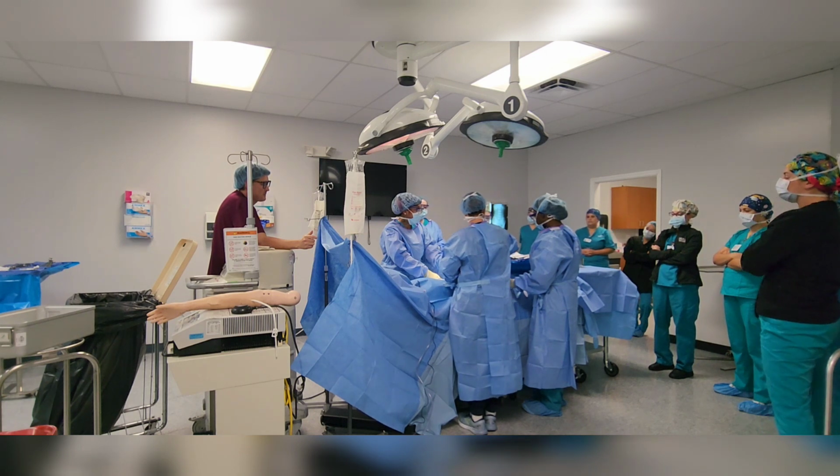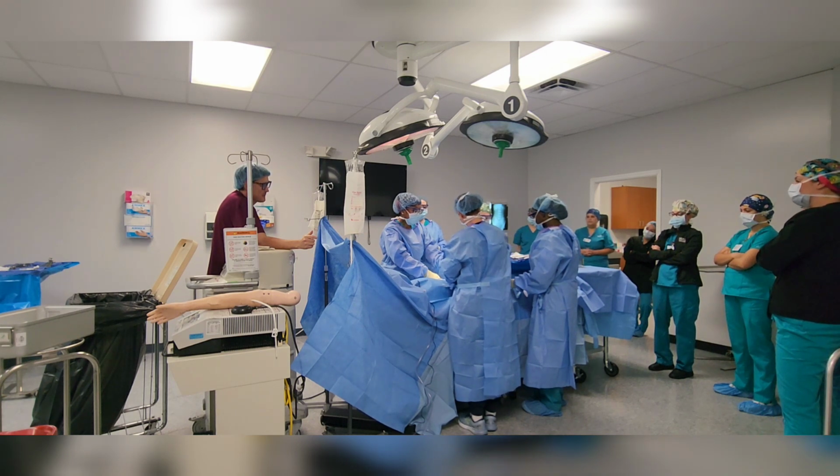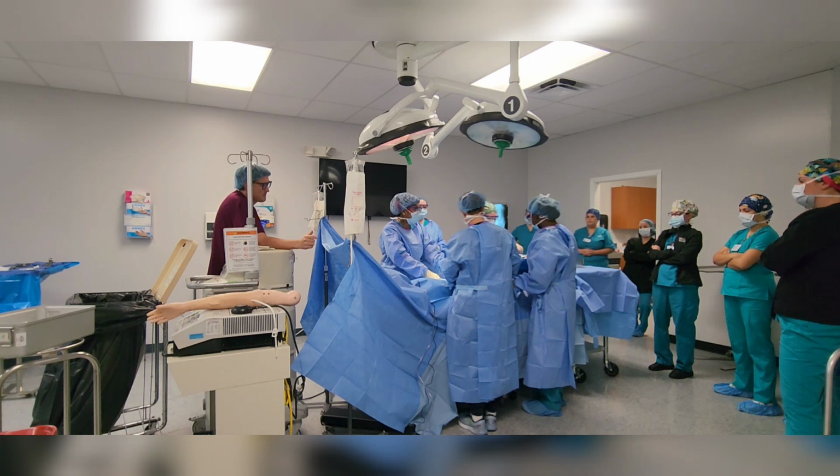Yep. Okay, then they're going to hand you the needle back, and when they do that, you're going to ask for a clamp. Can I have a Kelly?